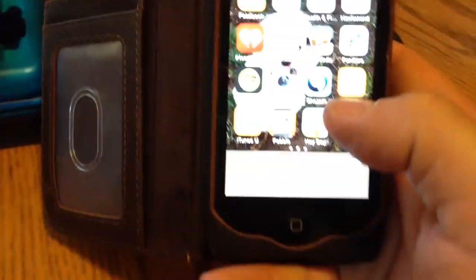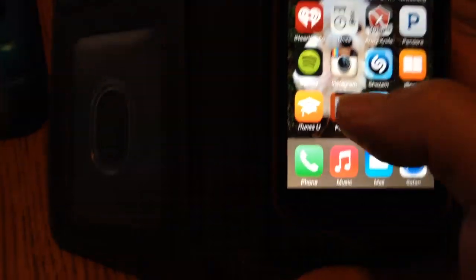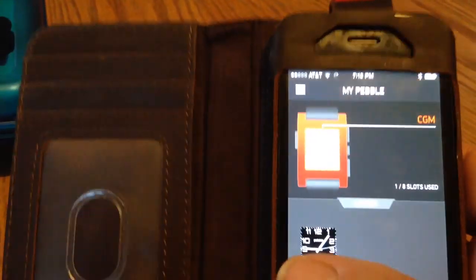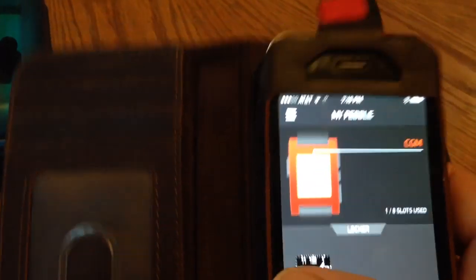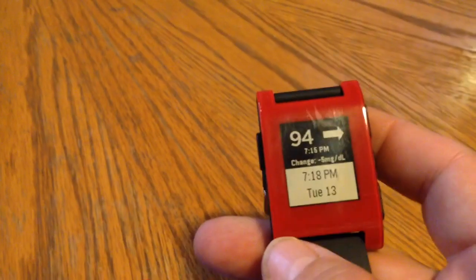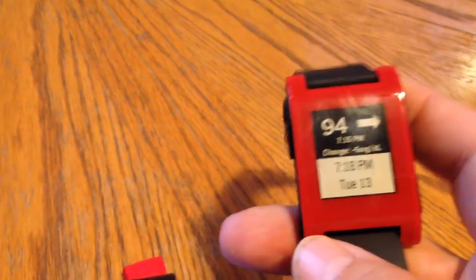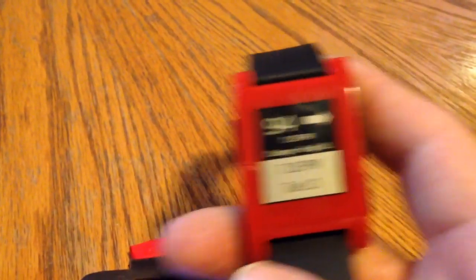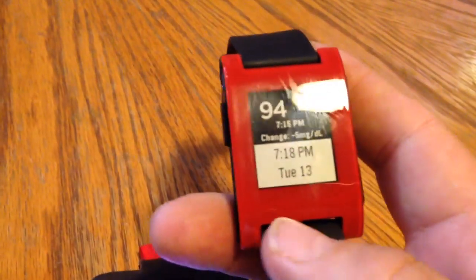From here, you can also connect it to the Pebble watch. The Pebble watch is right here, which now also says 94. Everything's been updated currently, everything's reading properly, you can wear this on your wrist.